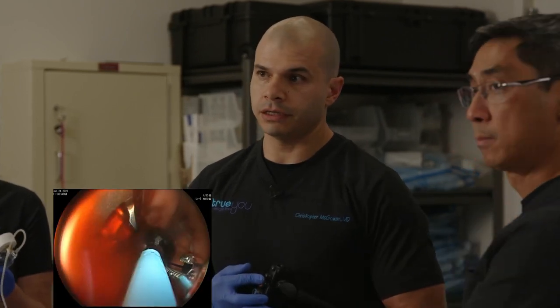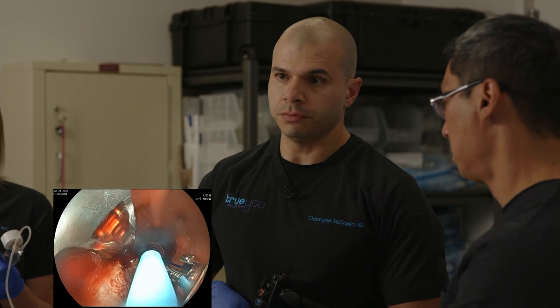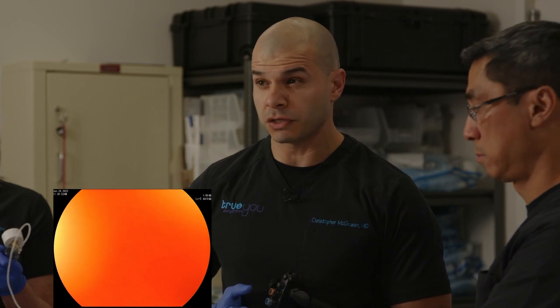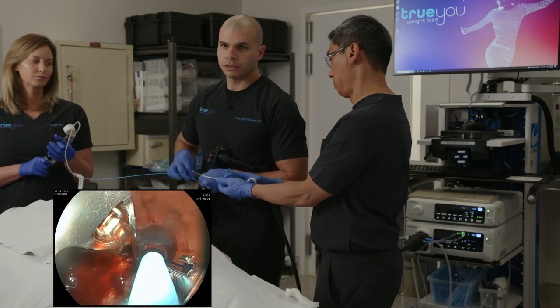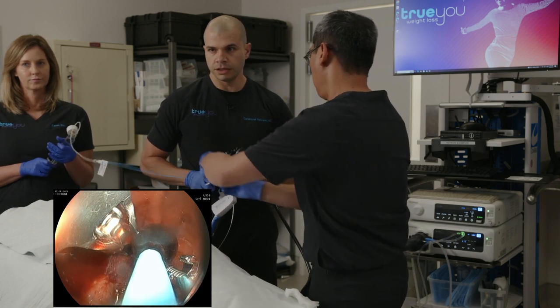Just gonna get some fluid out of there so everyone can see. I do want to maintain some level of visualization here. And I'm going to pull this nice and tight. So that's pulling in taut against the balloon. I realize that you can't see, but I'm doing this based on feel at this point. I will add a little bit of CO2 here just to get a look, make sure we're snug. And I'll pull that in a bit more. And we'll go ahead and cinch right here and deflate the balloon.